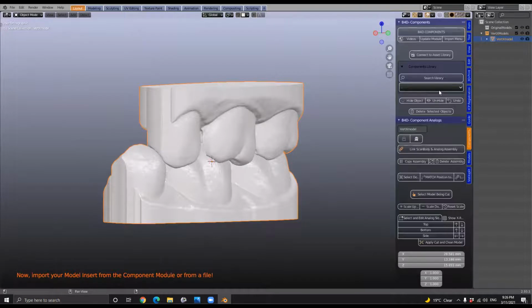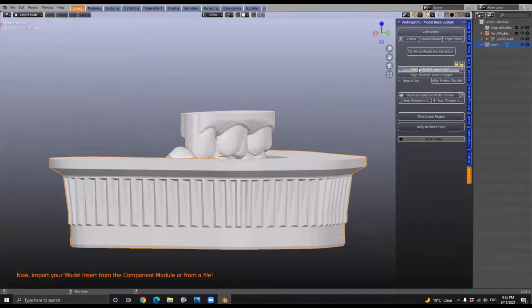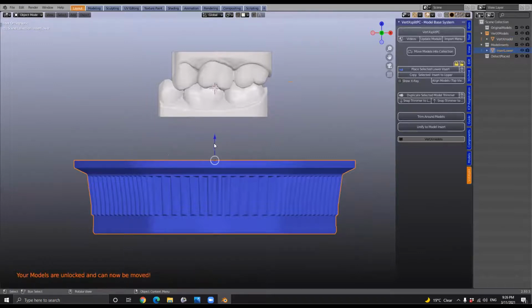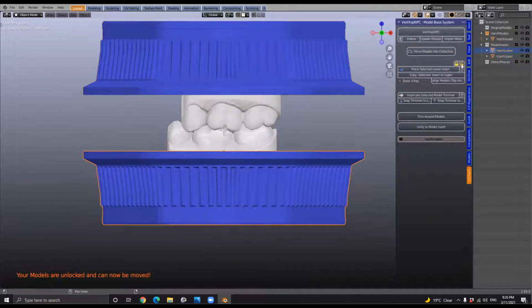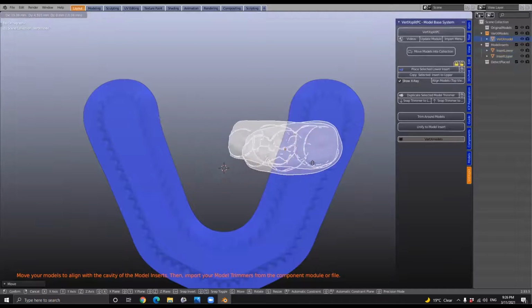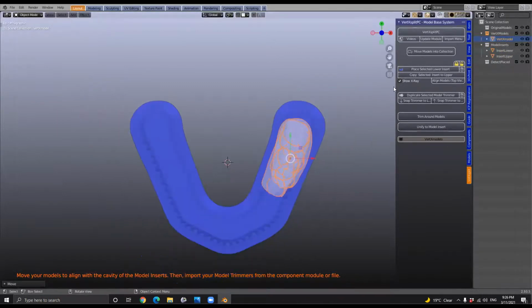So we're going to import our insert like that, and then from there we're going to place this insert. Now we're looking at it from the front view. Of course, it's way too far away. So I'm going to move that up a little bit, and then copy that to the other side. And that one is a little bit too low, so I'm going to move this one up a little bit, and move that one down a little bit. Then we're going to align these models, using the G key and the R key, just to bring them where they should be. Something to that effect.